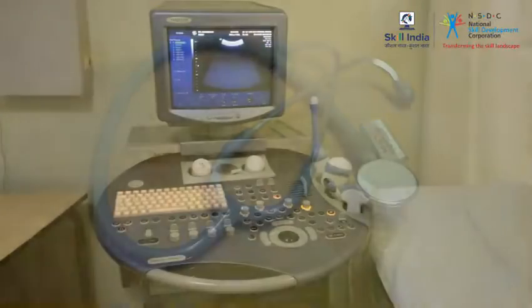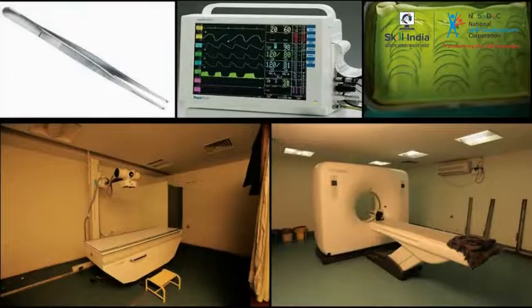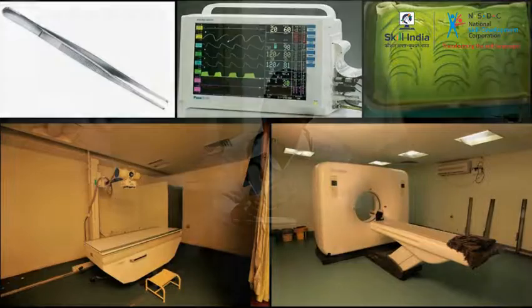You have seen some of the common surgical and medical equipment. In addition to these, there will be a lot of other instruments and tools that are used according to the needs of the patients. As a hospital assistant, it is your responsibility to identify and ensure that equipment is cleaned and ready for use by the doctor or the nurse as and when needed by them.